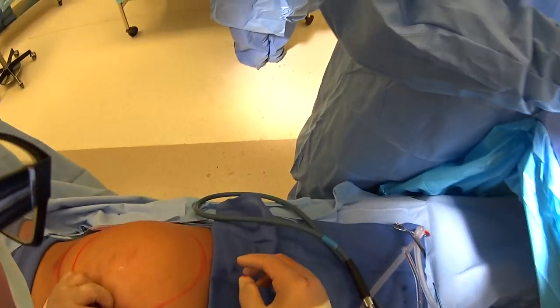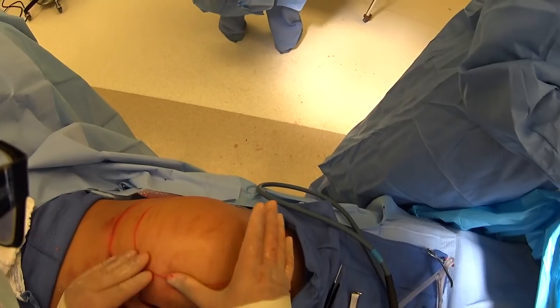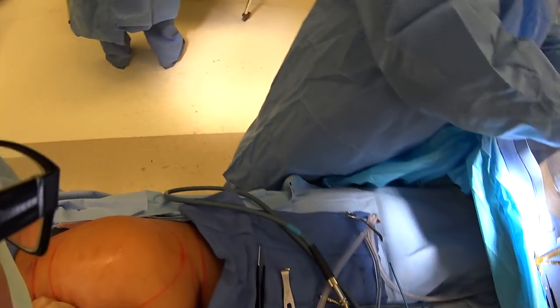That pocket actually looks perfect for her — it'll fit her really well. And we can still close it, protect the skin here, and it looks good.